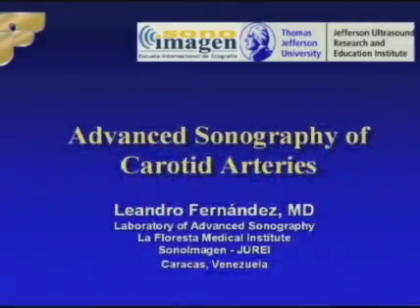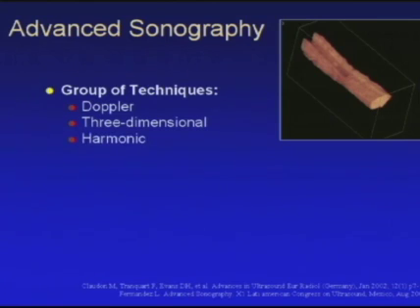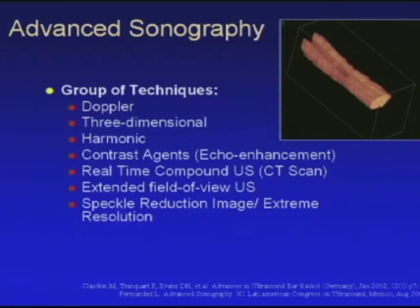Advanced sonography of carotid arteries. Let's begin by defining advanced sonography. This is a term used to refer to a group of techniques which include Doppler in all its modalities, three-dimensional ultrasound, harmonic ultrasound, contrast agents or echo enhancement, real-time compound ultrasound, which is related to CT scan, extended field of view ultrasound, speckle reduction imaging or extreme resolution imaging.